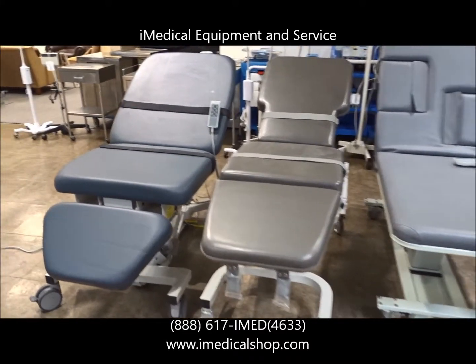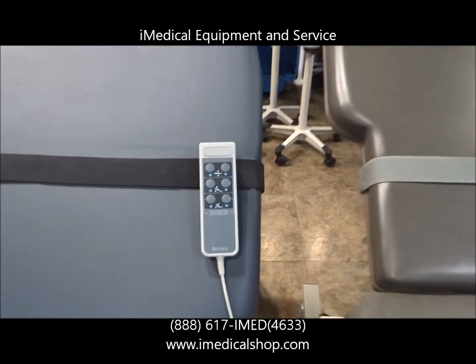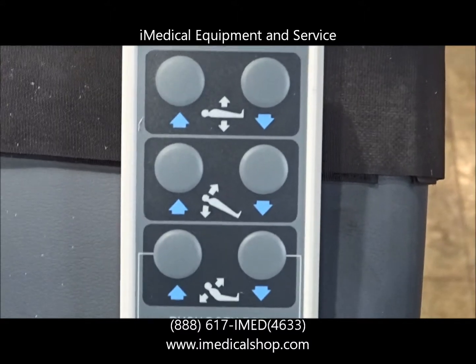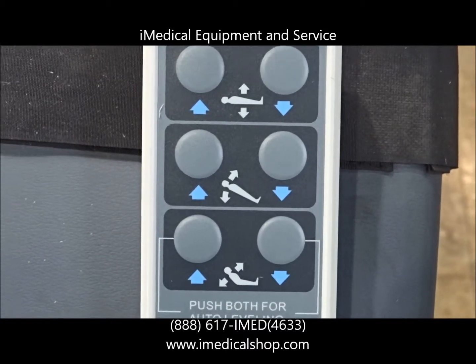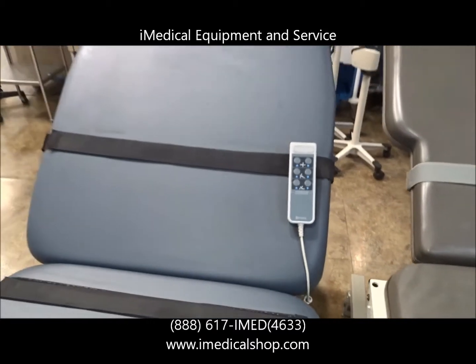We'll go through and show what some of the basic differences are. You have fully electric tables like this right here — you've got the power up and down, the Trendelenburg, and also the reverse Trendelenburg. And then you also have the head up and down, which is referred to as Fowler.